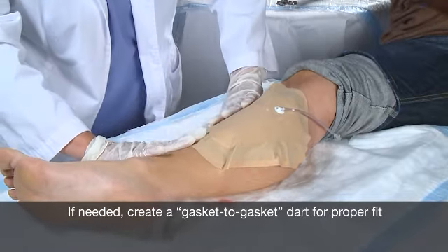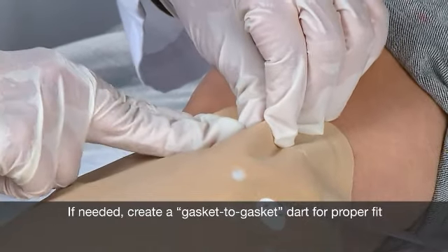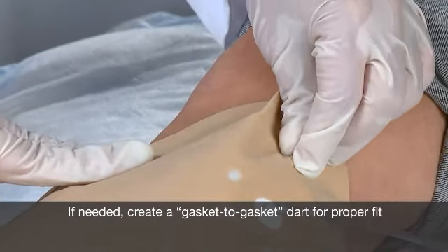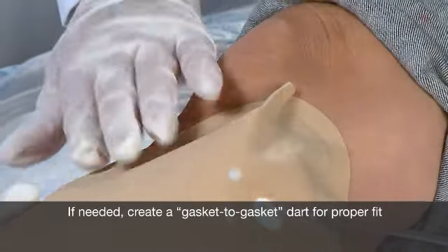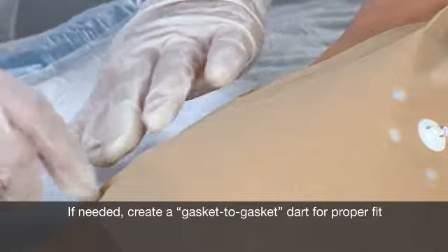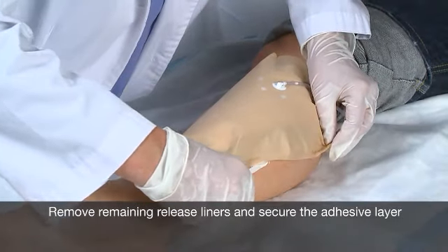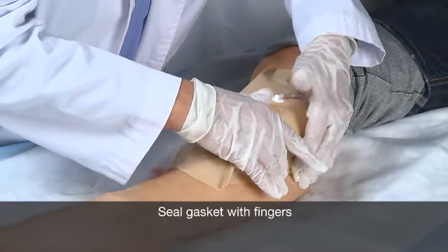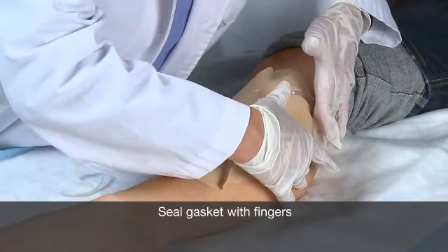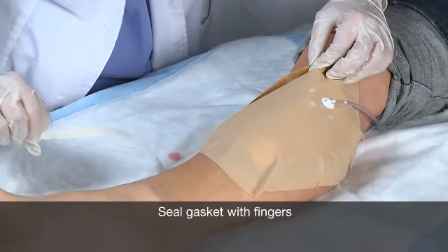Depending on the placement of the wound kit on the body, you may actually need to create gasket-to-gasket pleats in the gasket to accommodate the anatomy. You may also place tape over the pleats to help prevent the wound kit from dislodging. After the gasket is sealed, remove the remaining release liners and secure the adhesive border to the skin. Once the wound kit is attached, push down with fingers along the perimeter of the gasket, pressing firmly to create an air-tight seal.